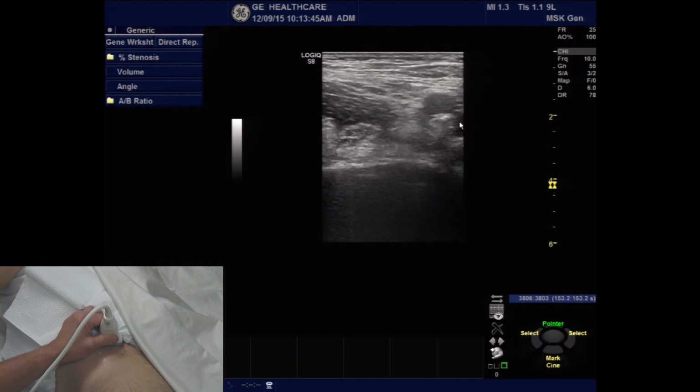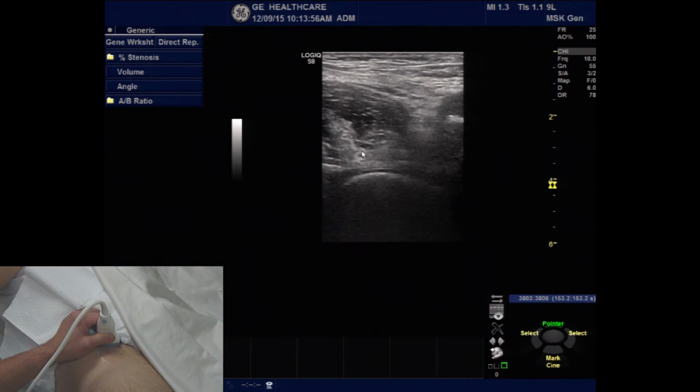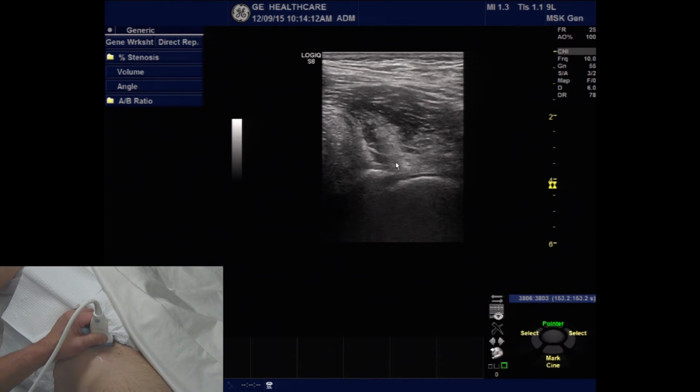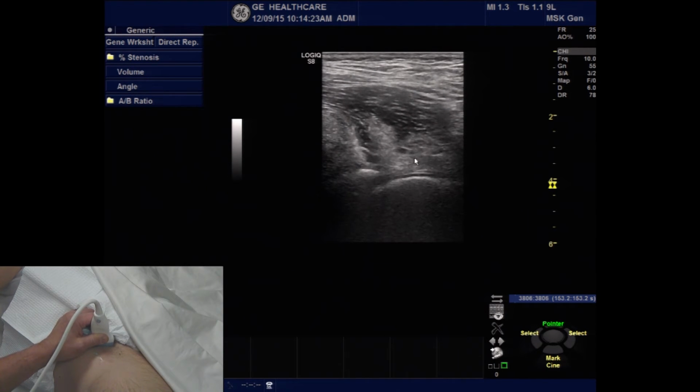So as I slide my transducer medial, I can see the pulsation of the vessel of the artery, I can see the femoral head, and I can see the area of the conjoined tendon sitting on top of the acetabulum. Moving the transducer slightly lateral again, the approach for injection into the iliopsoas would be from a lateral to medial, from a superficial to deep approach, and approximating the needle in the area of the iliopsoas tendon structure in its short axis. This is a good way to avoid any type of the major arterial or nerve structure in the anterior part of the hip.